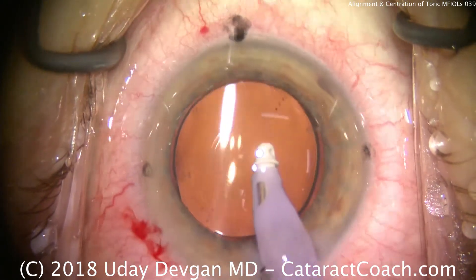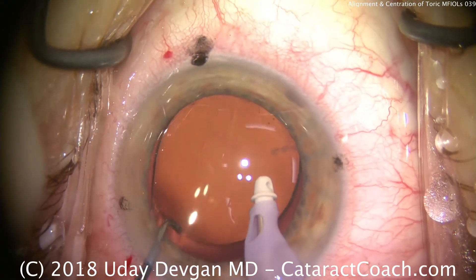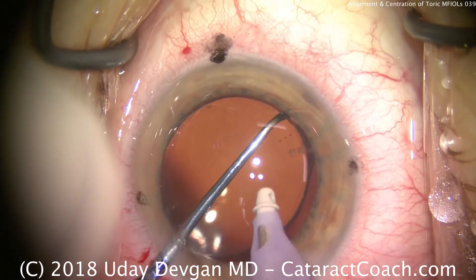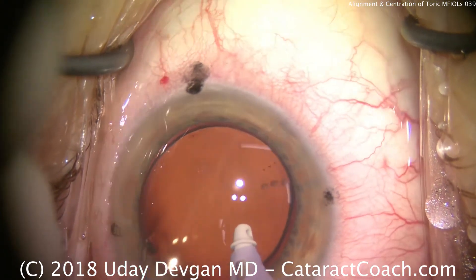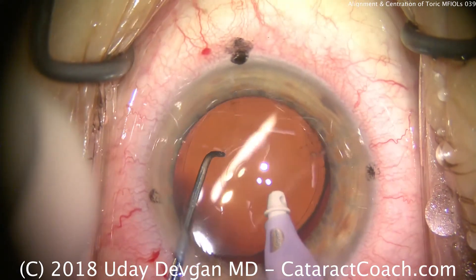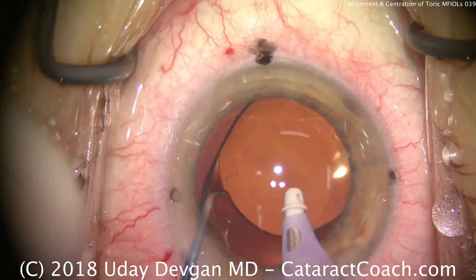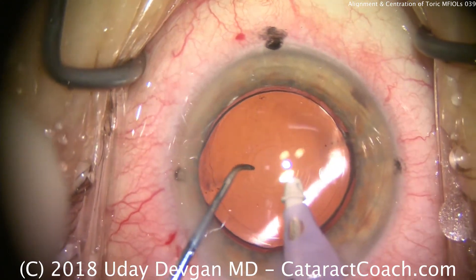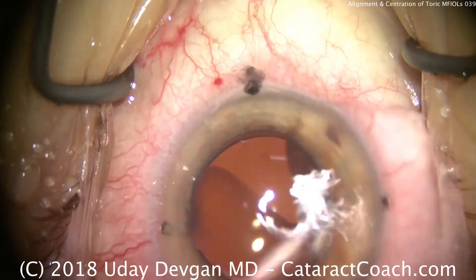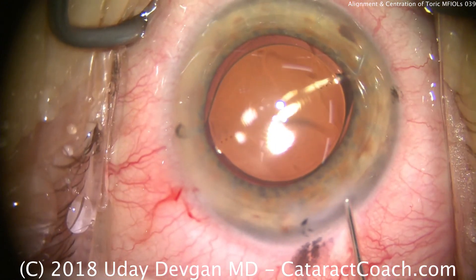We'll use our chopper to help rotate the lens and line it up. The I&A probe is in the eye providing infusion so the eye stays inflated. Slowly we rotate it — you can see the three toric marks on the lens, and those need to be lined up with the marks we made on the cornea. That looks really good; just nudge it a tiny bit more. Now, to avoid parallax, we need to line up the Purkinje images. You see the first Purkinje image on the cornea, and then there's the fourth Purkinje image — the inverted one — coming from the IOL. We line up the Purkinje images and that tells us the center. The lens is now in the correct axis, and the Purkinje images confirm that the lens is beautifully aligned.